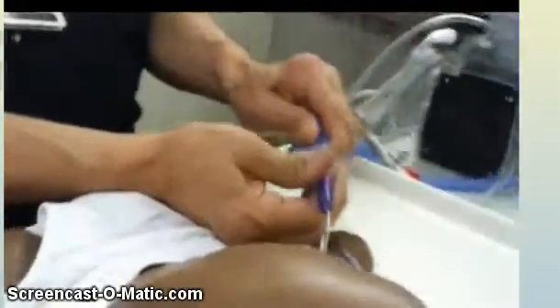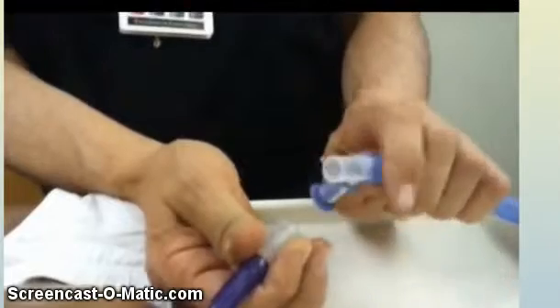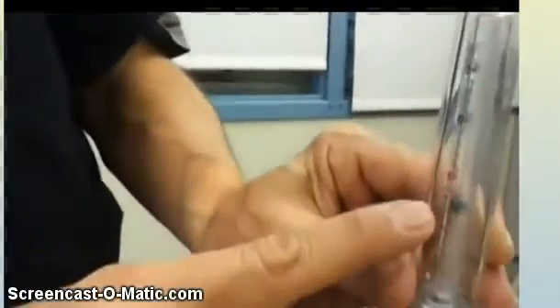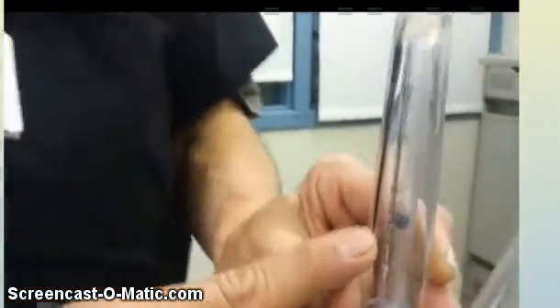Right here we have a separation which allows us to break the circuit. We can put an inline oxygen analyzer in. We'll be able to definitely analyze what the precise oxygen concentration is. Okay. And this one here we've backflooded. So this patient is getting oxygen as well as 4 liters of high flow nasal cannula. Any questions, please feel free to call us.